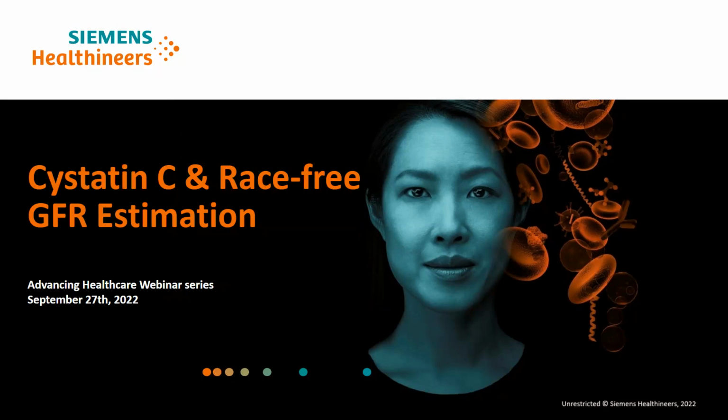Yeah, thanks so much for this question. So I alluded to this a minute ago that traditionally Cystatin C has been run in more specialized laboratories, but some manufacturers have put the assay on the clinical chemistry instruments that are in more laboratories and acute care laboratory settings and make the testing more widely available.